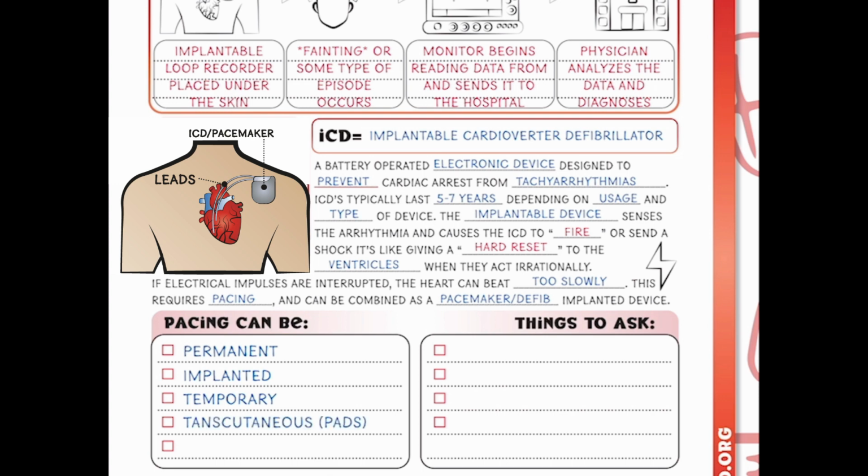We also have transcutaneous pacing, and this is known as those pacing pads that we put on top of the chest, and we're able to dial the amount of electricity and how fast we want to pace. And the biggest thing to note here is you want to make sure that your patient is comfortable. Pacing can be very painful, especially if you're requiring more electricity. So we want to make sure that we have adequate pain control, or potentially we're sedating our patient for this moment.